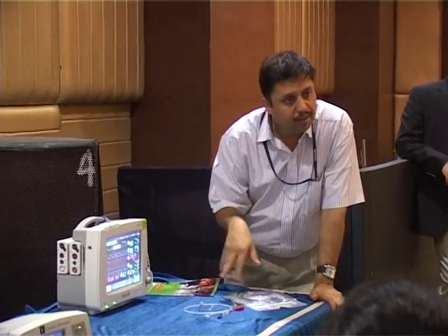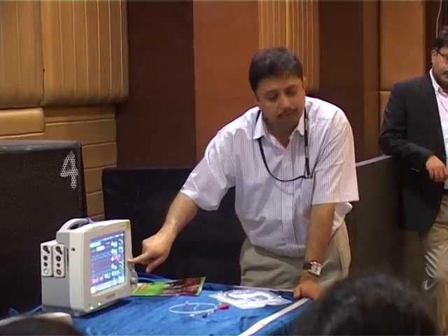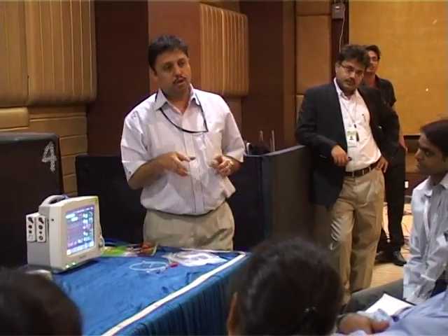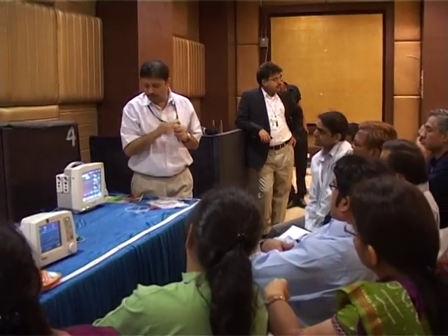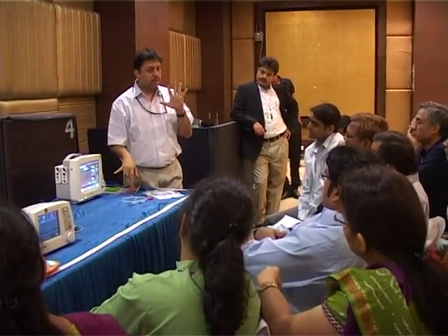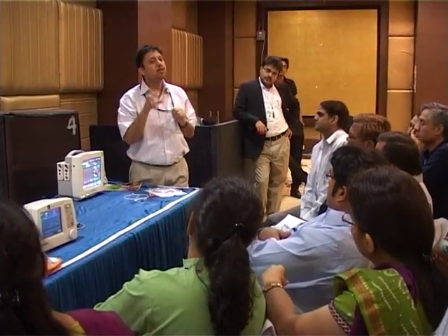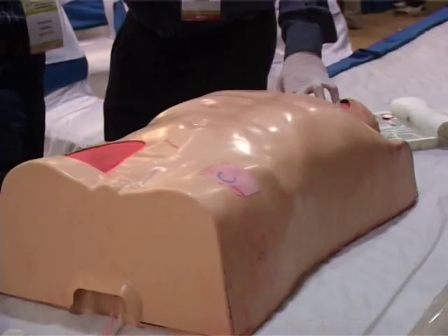Now let us look at the parameters available from this. We have extravascular lung water, which is 515 ml. Global end-diastolic volume is nothing but a combination of blood in all 4 chambers of the heart. You come to know how much it is. Then you come to know intrathoracic.